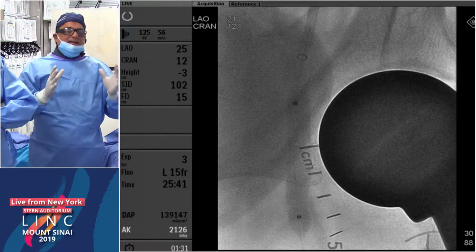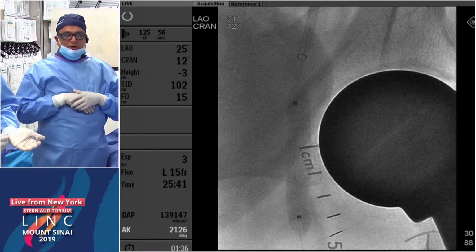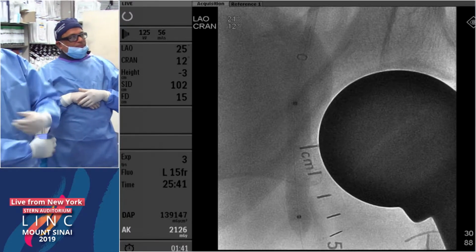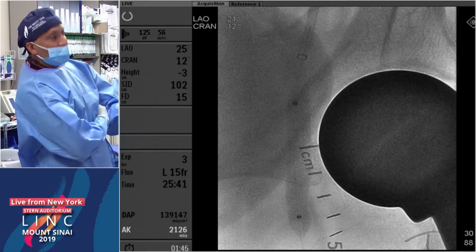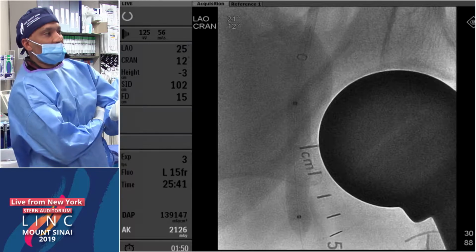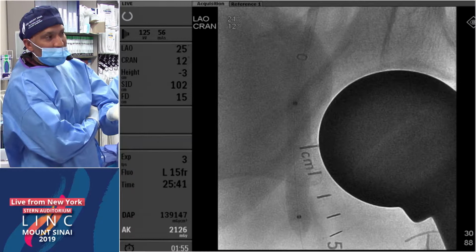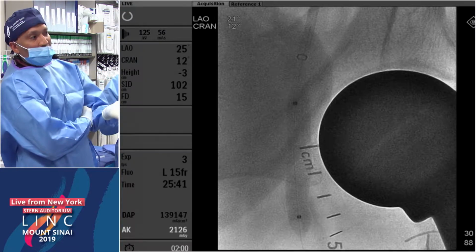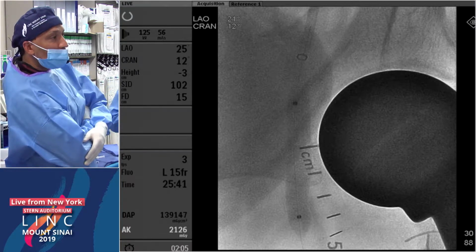We know it wasn't technically challenging, but I think there was a lot of decision making here that really affects the real world interventionalists. And Dirk and Dr. Bacharach, the main reason for not stenting her on the other side, my reasoning was she has cardiomyopathy, a very low flow state. She has an SFA-CTO even on the right side. I just felt like, for a low flow state, 84-year-old patient, if she still has outflow disease, SFA-CTO, and she has any issues with that stent, now I'm causing her more trouble than anything else. That was the main reasoning behind not stenting. But those are great points, though.